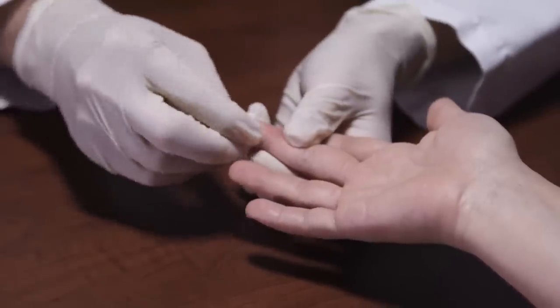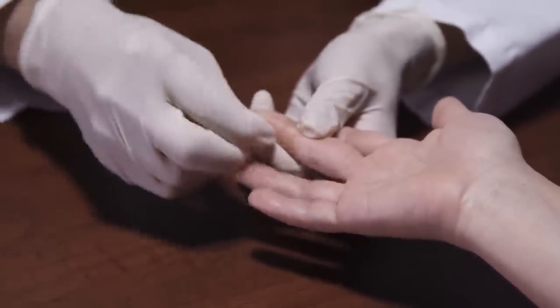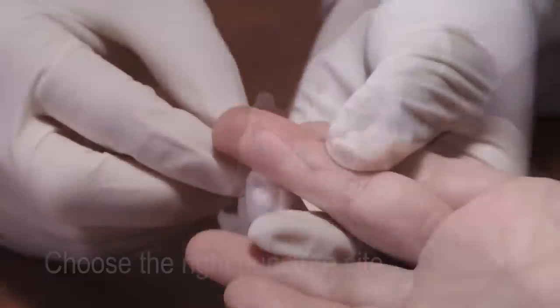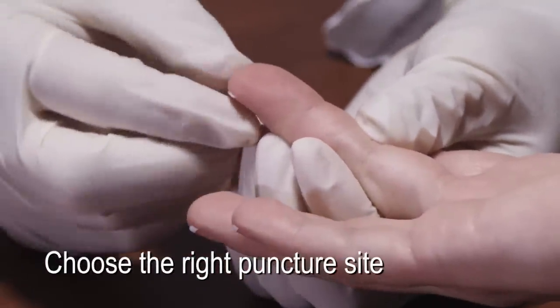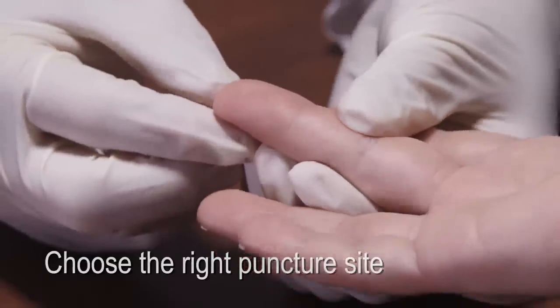Clean the testing site with an alcohol swab, then air dry the testing site thoroughly. Puncture the side of the middle or ring finger for easier sampling. Use a different finger if the finger is callous.